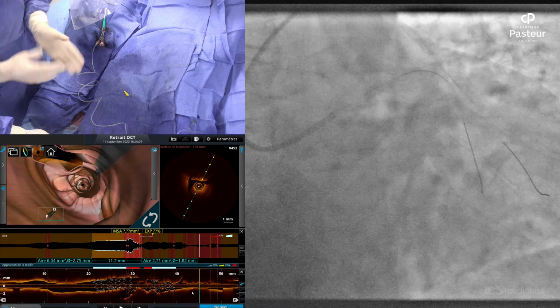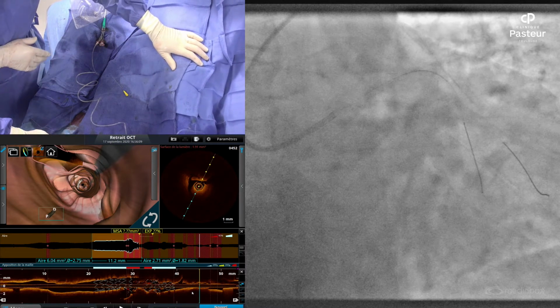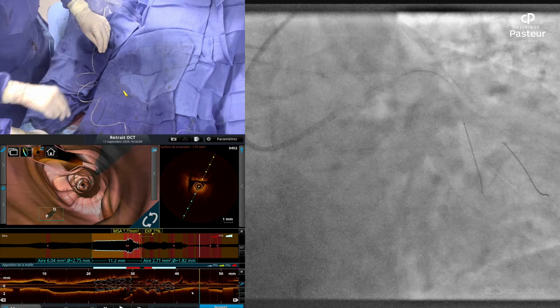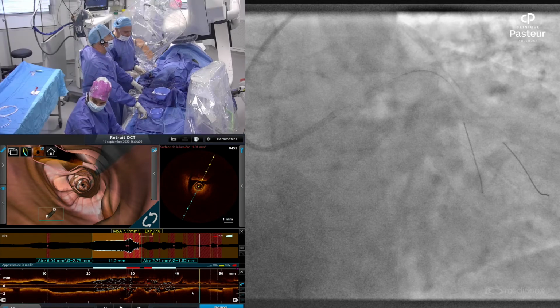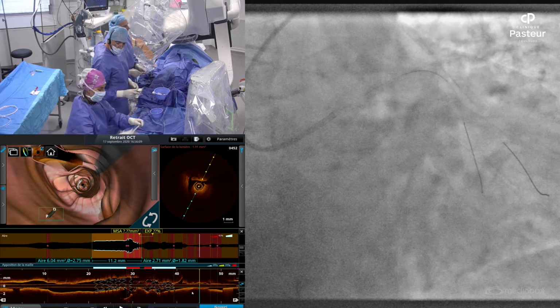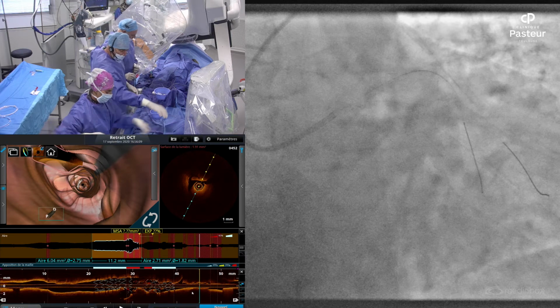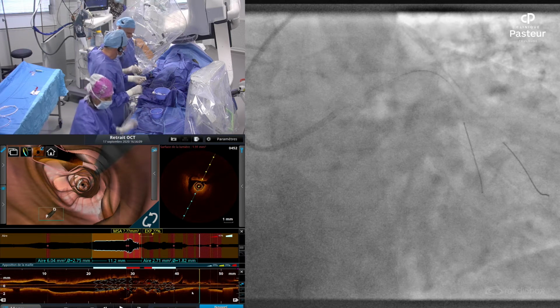What we should avoid is going with the stent too distal and onto the LAD diagonal bifurcation. Yeah. No, 26 should be okay, I think. Yeah, because we have to cover the ostium. If we decide to treat the left main, we have to start from the ostium.